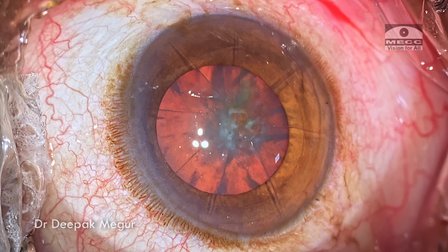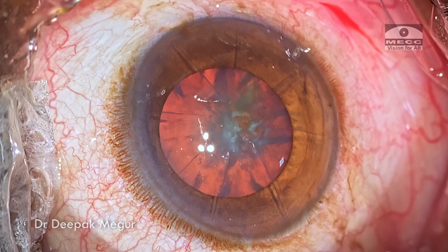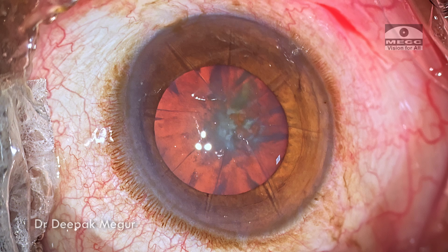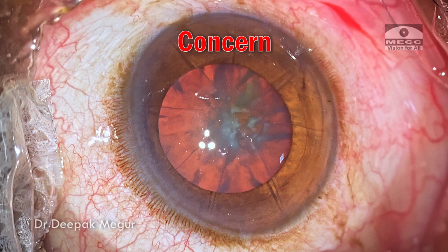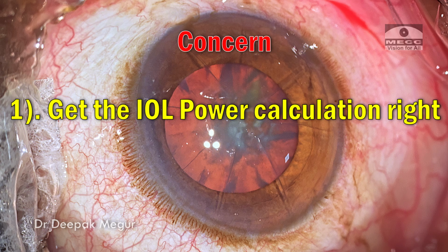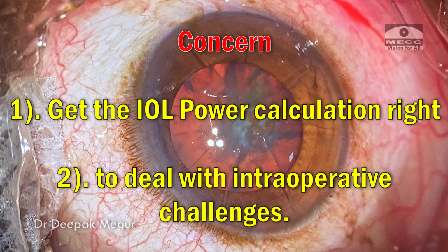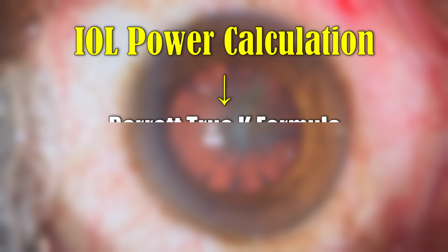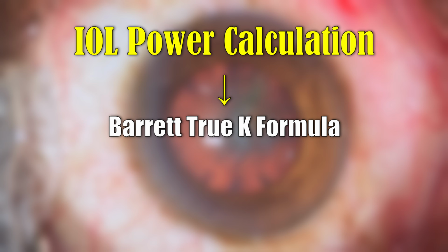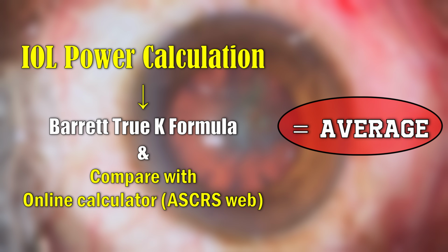Now, planning a cataract surgery in eyes who have undergone previous refractive surgery, especially radial keratotomy, is a challenge. The concerns in this case would be twofold. Number one would be to get the intraocular lens power calculation right, and number two, to deal with the intraoperative challenges. For IOL power calculation, I'm going to rely on the Barrett True-K formula and then compare it with the online calculator at the ASCRS website, and then probably take an average.